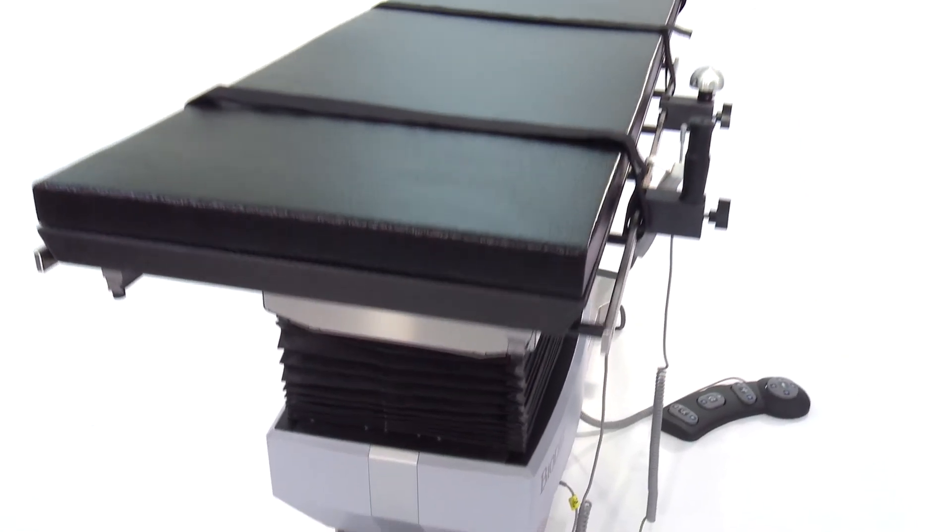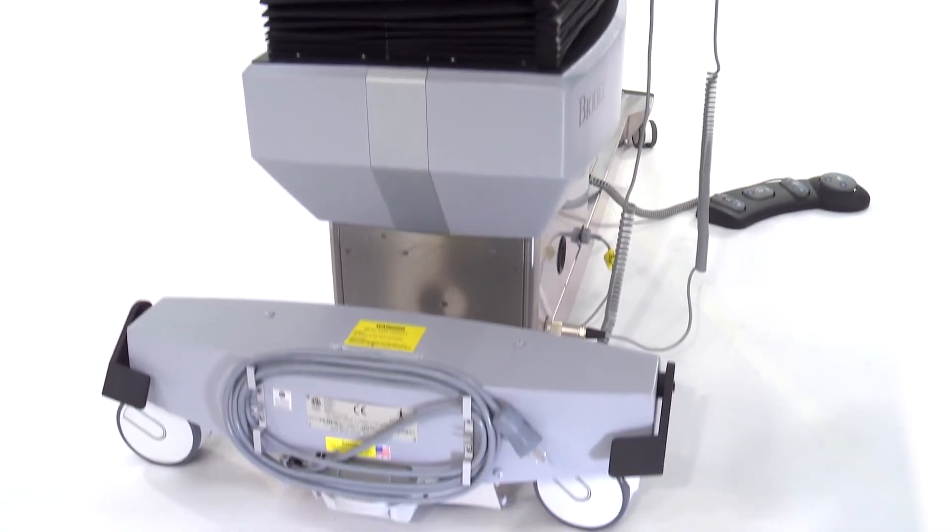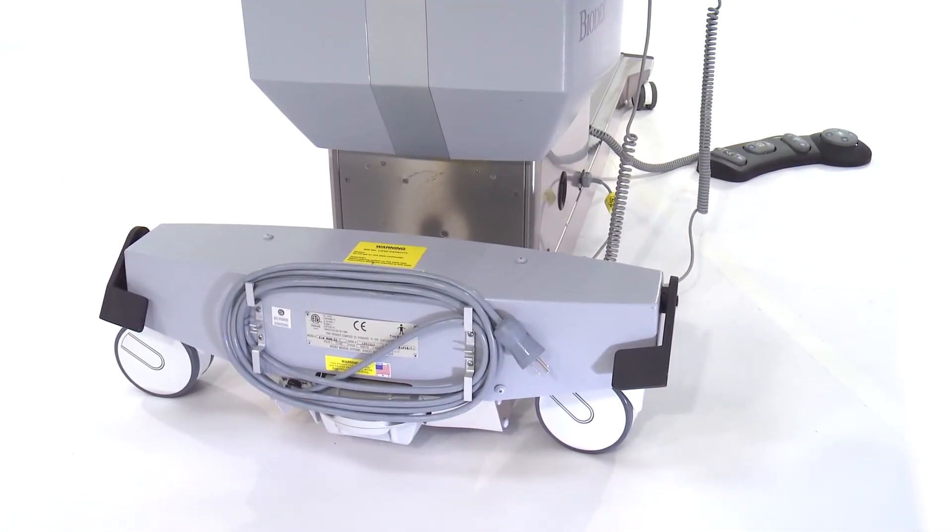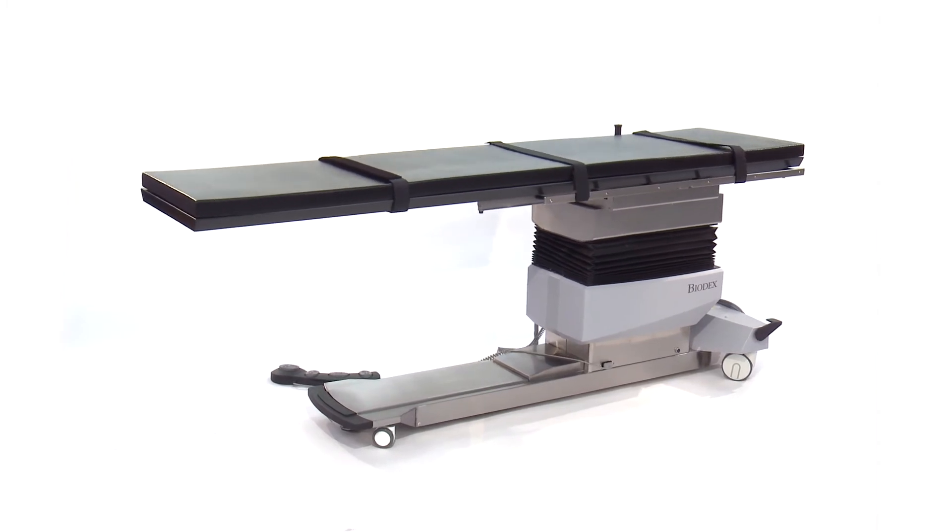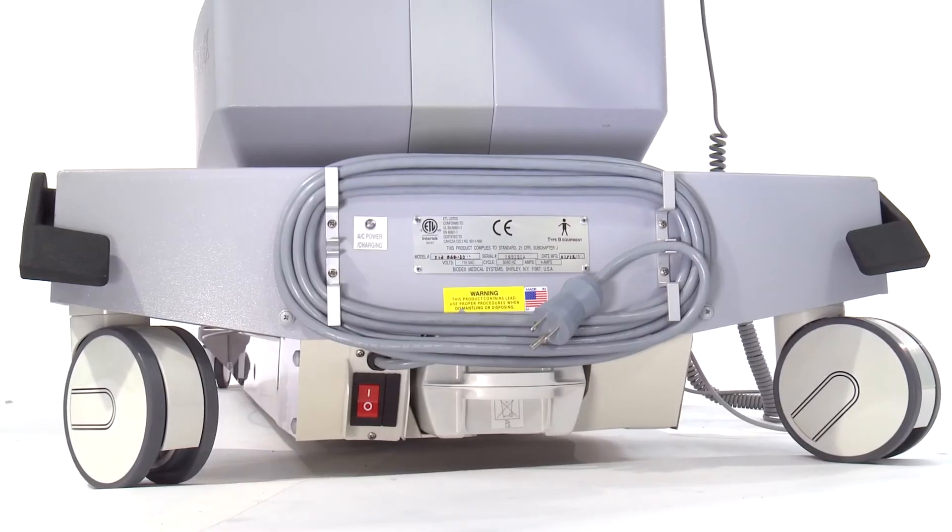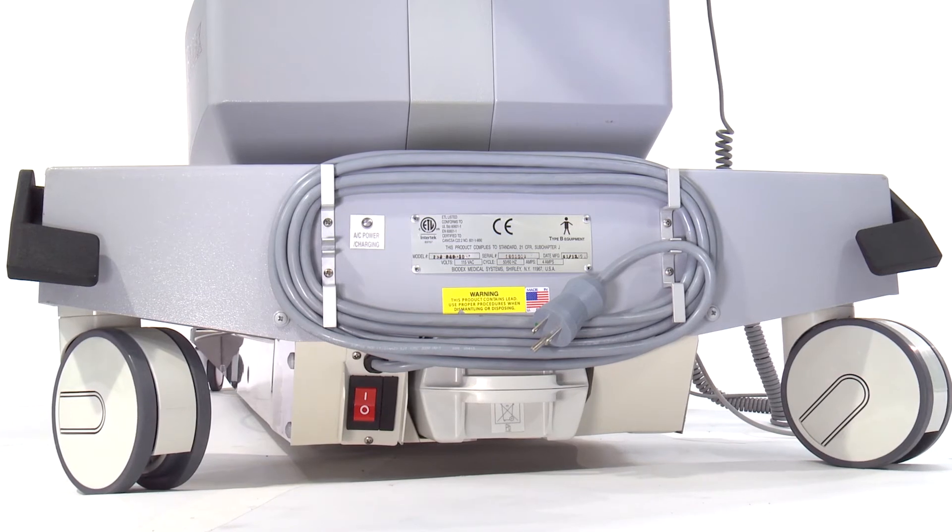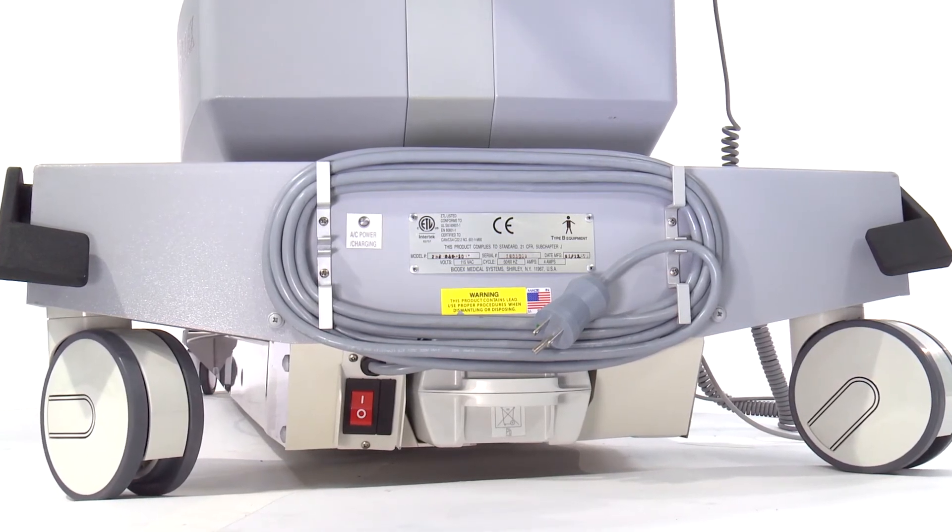Both AC and battery power are standard in the C-Arm Table 840. When running on battery power, there are no cords underfoot to hinder movement. An optional battery with a separate charging unit can provide continuous cordless operation.